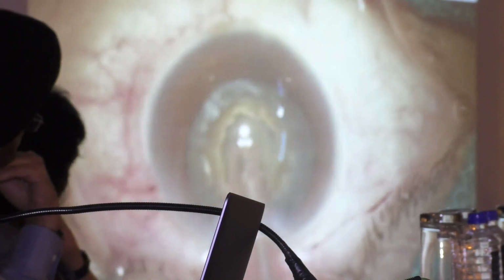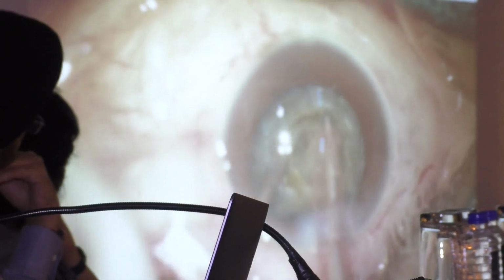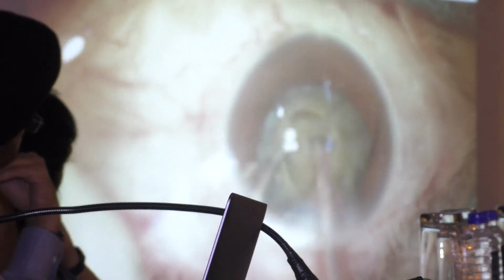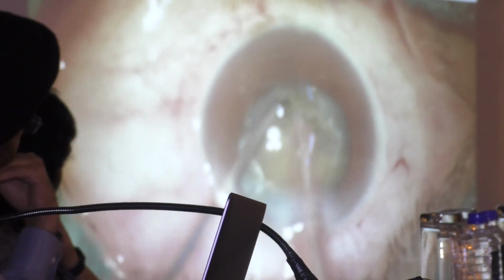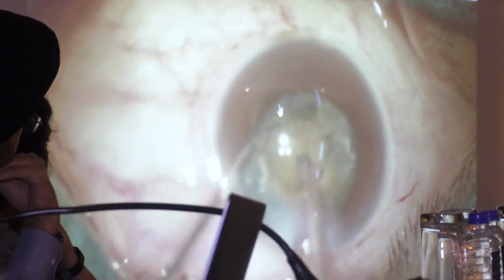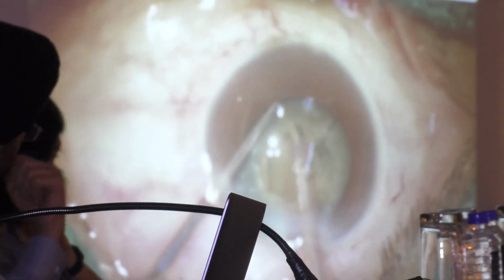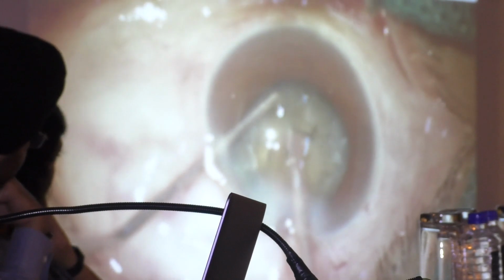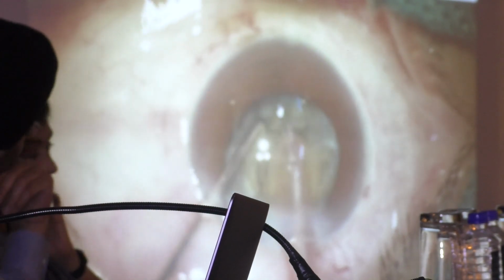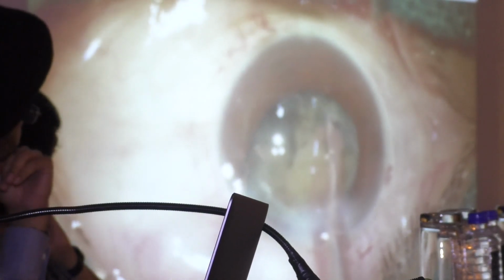I'm rotating simultaneously, and with the Phaco itself you can rotate it all around. Later on you can show, as Dr. Malay has shown, the peripheral layer separation folded at the margin. By making it, you can fold very easily, and you can break the nucleus in small pieces. In this case still the center plate is there, so you can make the trench slightly deeper so that there is no plate in the center. This is the better technique in case of a very hard nucleus.